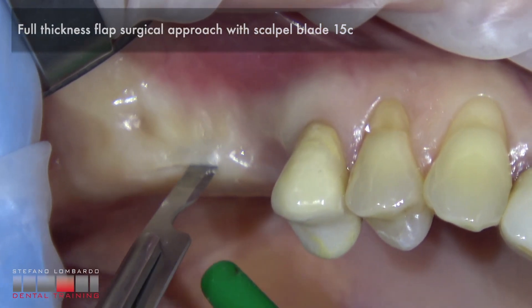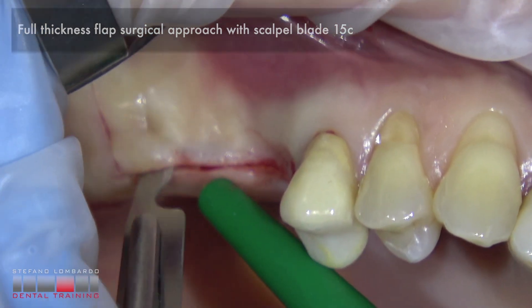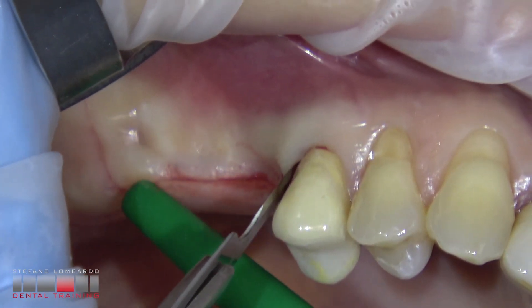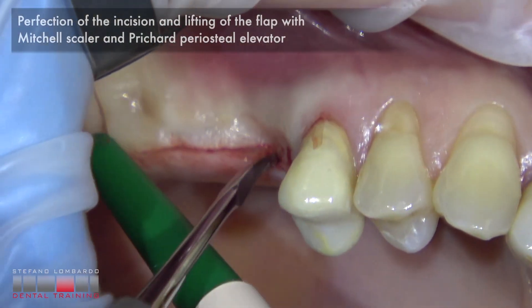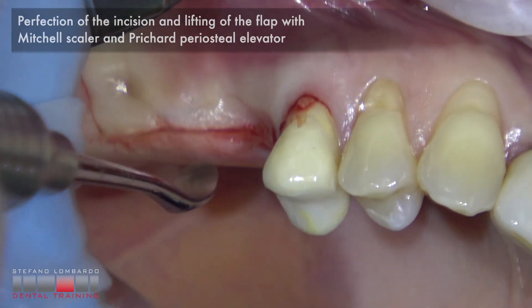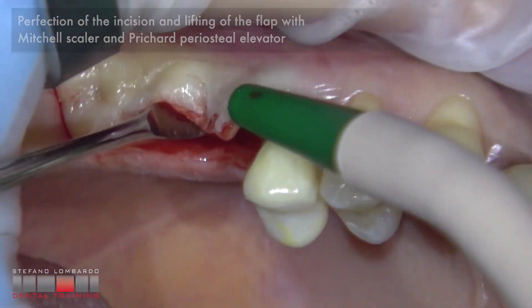The full thickness flap surgical approach with scalpel blade 15C. Perfection of the incision and lifting of the flap with Mitchell scaler before and Prichard periosteal elevator after.